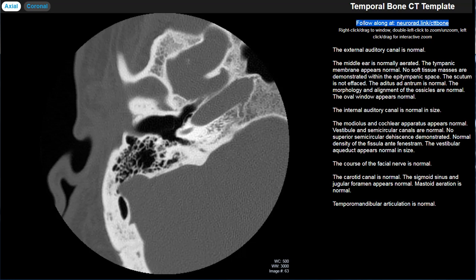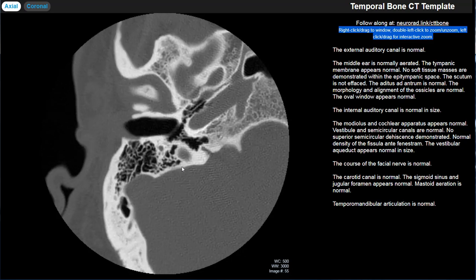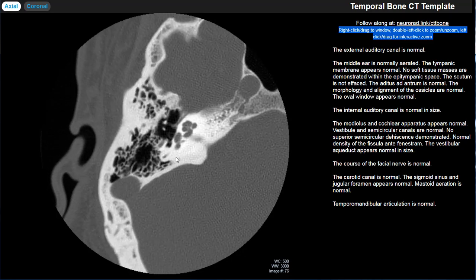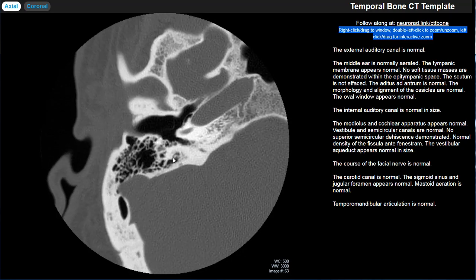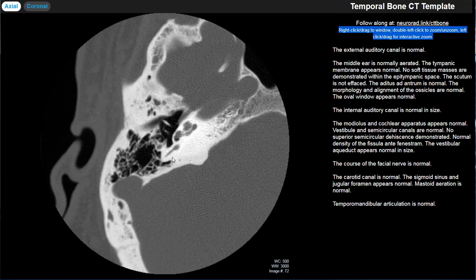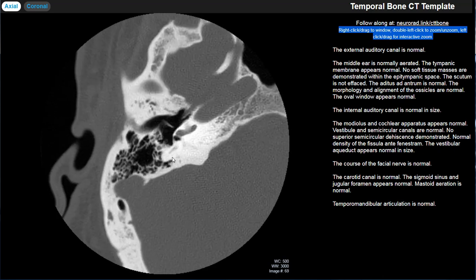That will bring up a web page looking pretty much exactly like what you're seeing right here. This is actually a little DICOM viewer, so you're able to scroll through a temporal bone CT — scroll through the sequences much like you would in a PACS setup.